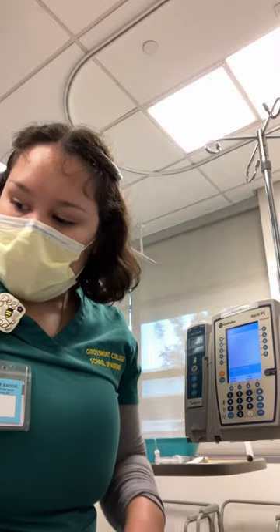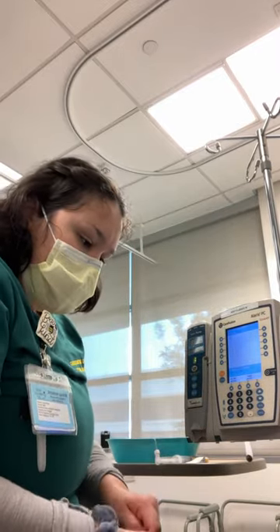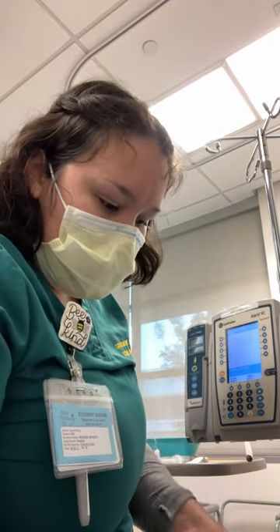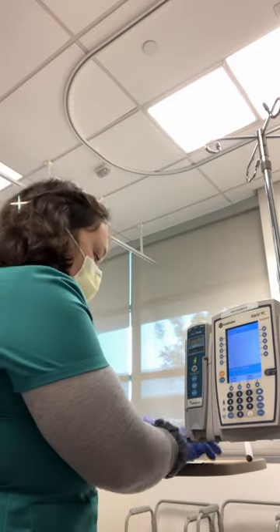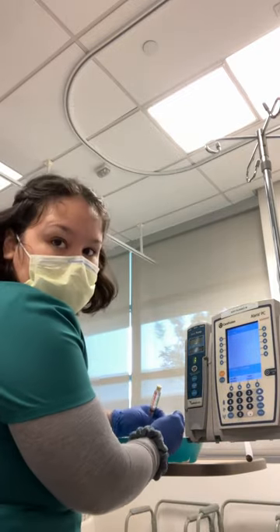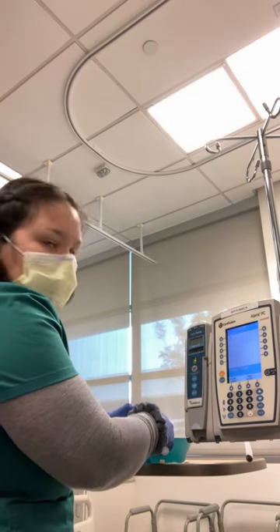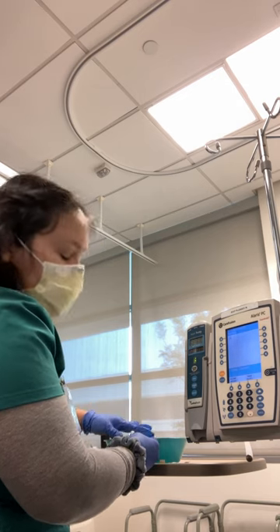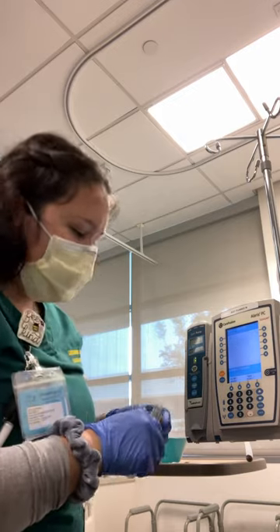I'll do hand hygiene. I'm going to look at the site for signs of infiltration like redness or swelling. I need to ask the patient if they feel any pain when I flush. I'm going to scrub the hub for 15 seconds. I have my flush and I'm going to flush about three to five ml slowly, asking if they feel any pain, and feel over the site. I don't feel any resistance, so this IV site seems good.